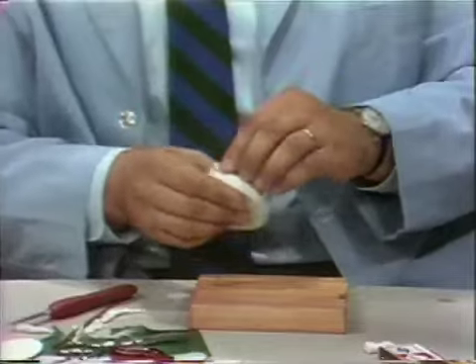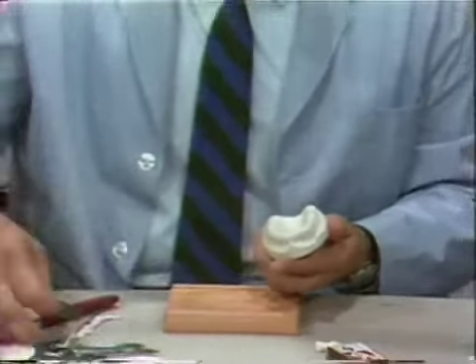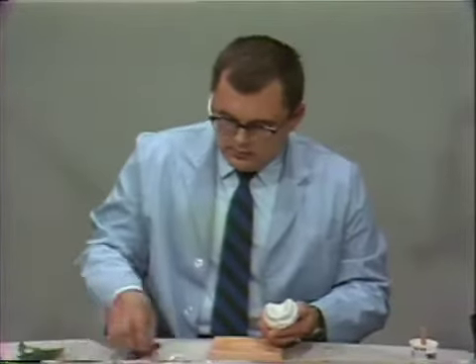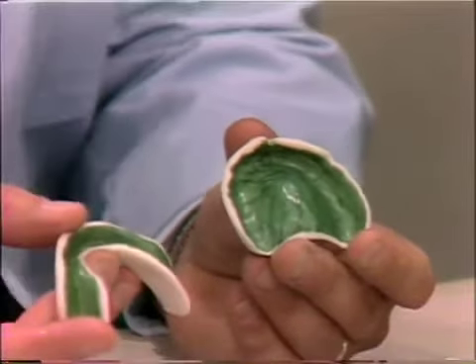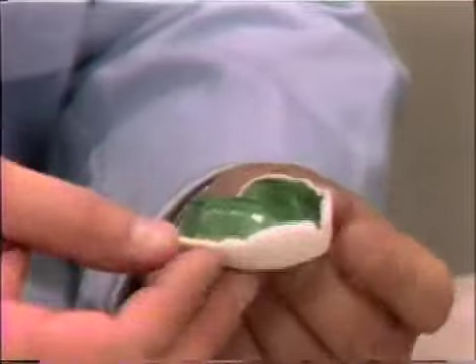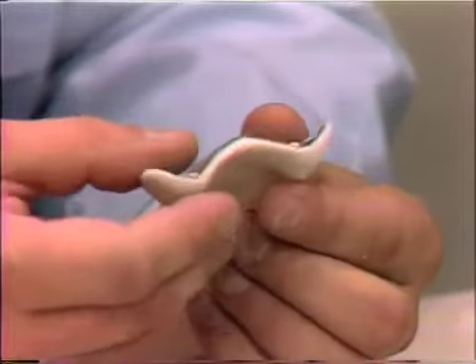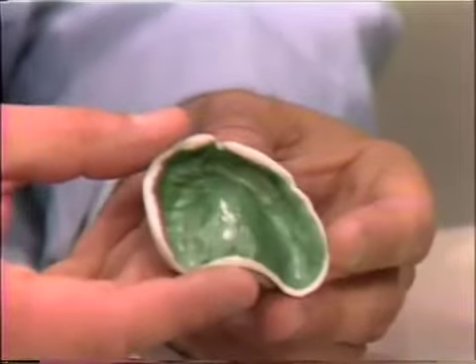Note that we keep the wax spacer just short of the area penciled on the cast, so that when we go to the mouth to border mold the impression tray it will be supported by the acrylic extension of the flange. To facilitate matters, I have already made the final impression trays on this model and retrieved them. You can see that the wax spacer was retrieved along with the acrylic tray from both the upper and lower impressions. The tray really should look like a denture without teeth on it if you've constructed it adequately. The more accurate your final impression tray, the easier it is to secure an accurate final impression.